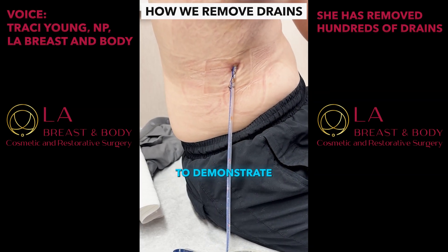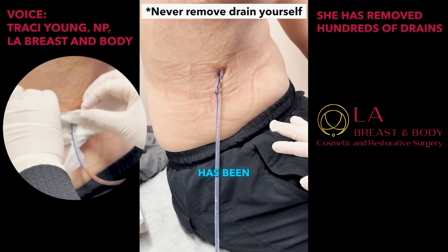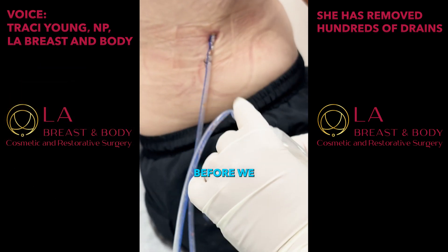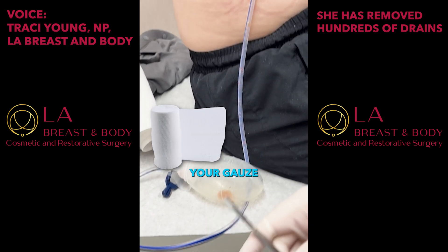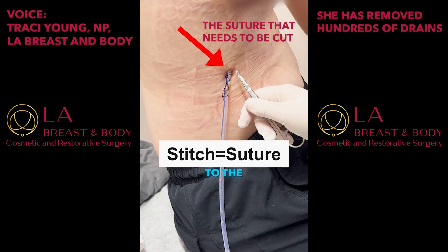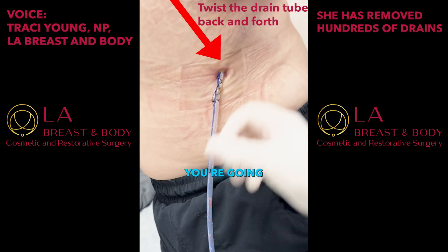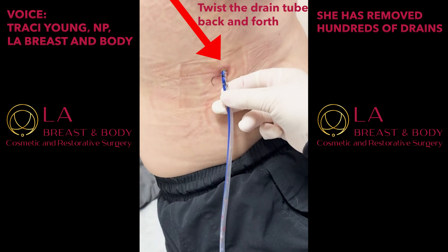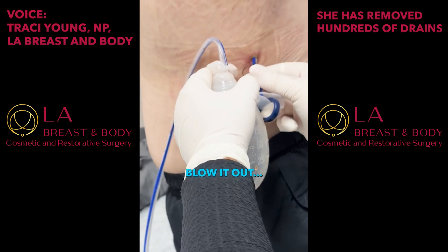We're going to demonstrate a removal of a surgical drain. The dressing has been removed. We need to take the bulb off suction before we take the tube out, because you want to release the pressure. Have your gauze and tape dressing ready. There is a stitch holding the suture to the skin and we're going to cut that. You're going to feel a little pinch as the suture comes out. On the count of three, you're going to take a deep breath in and blow it out — one, two, three, blow it out.